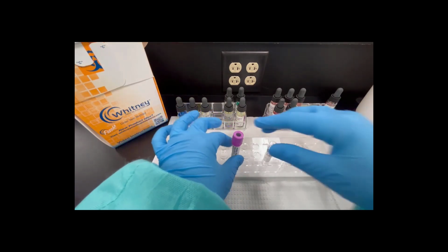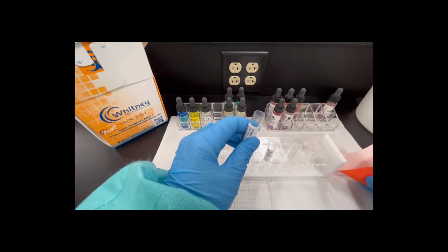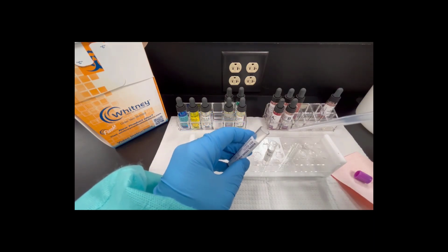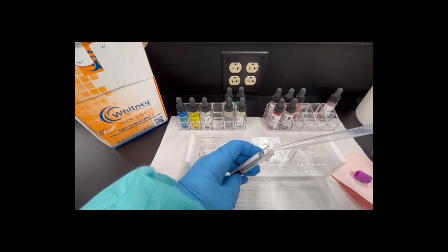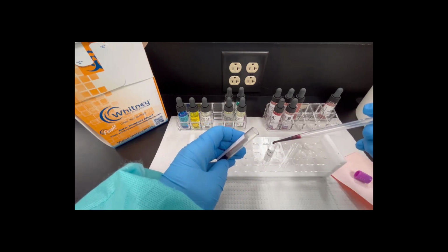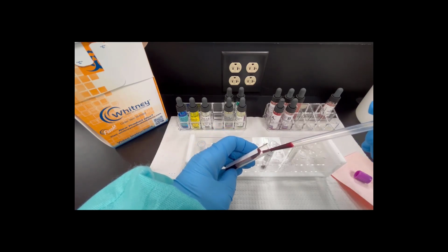I'm going to get my BioSquare and pop this lid off. Now, it's already been off, so at this point my cells are probably in pretty good shape, but I still am going to keep it there so it stays clean. I'm going to squeeze my pipette bulb, go in, and pull up some cells, and I'm just going to put a couple of nice big drops into that tube. And then I'm going to put it back and get rid of those cells.